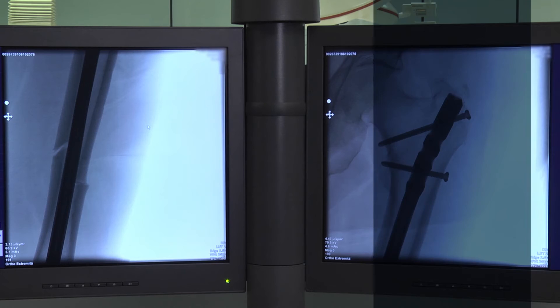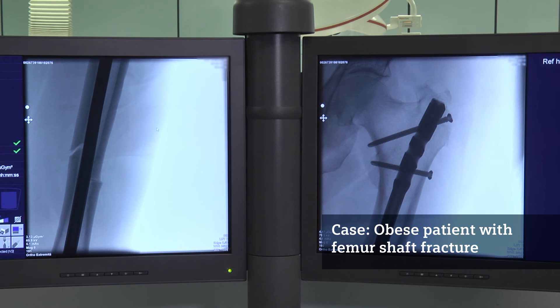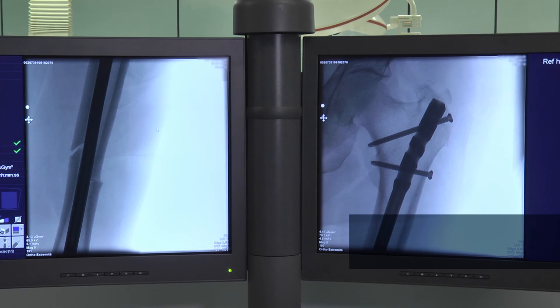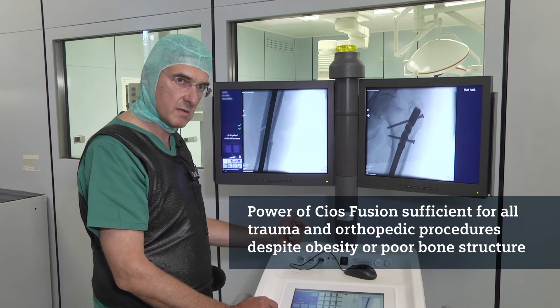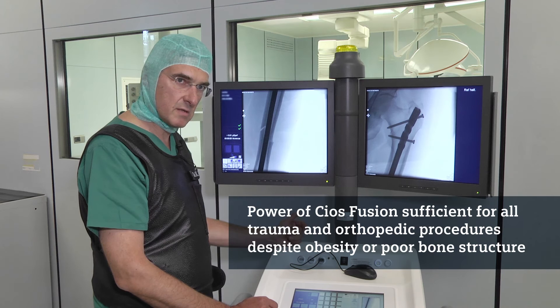In another case from a couple of days before, I would like to show some images of a patient with a shaft fracture of the femur on the left side — and this was a very obese patient. I can really state that the power of this device is absolutely sufficient for all trauma and orthopedic procedures you can imagine in the theatre, even if patients are obese or even if they have bad bone quality.